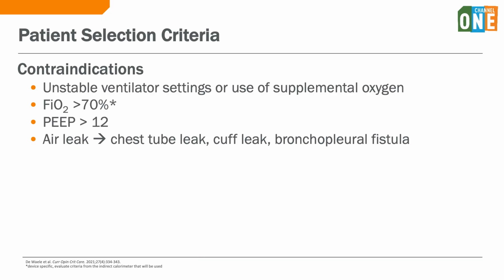These factors disrupt the measurements of the inspired and expired gas volumes, leading to inaccuracy of VO2 and VCO2 values. It's important to become accustomed to recognizing factors that alter metabolic rates or interfere with the analysis.